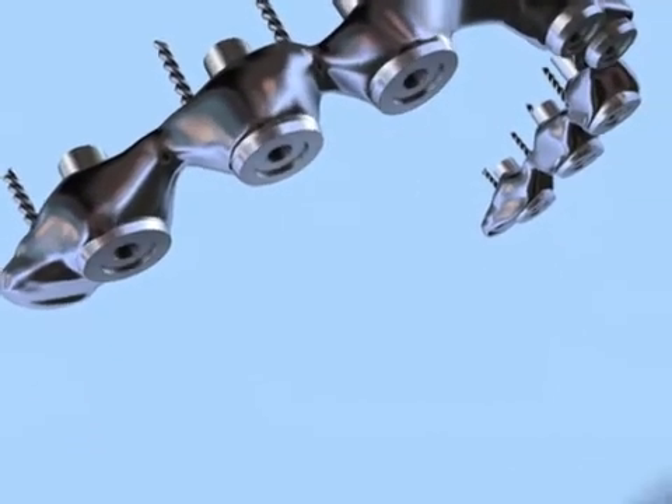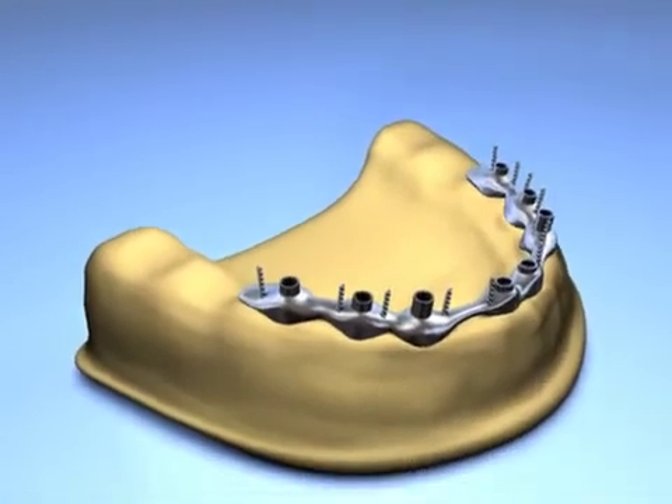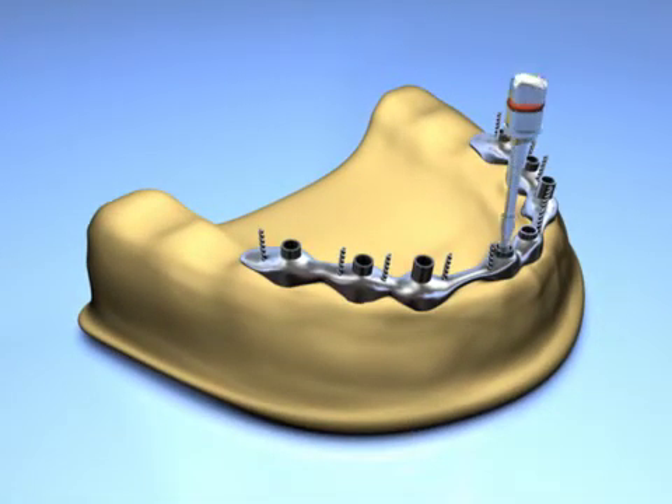Once completed, the assembly is then securely fastened back onto the master model using the same lab Flat-1 abutment retaining screws, and the composite resin cement is allowed to set.